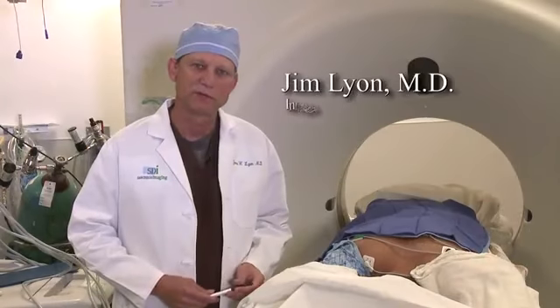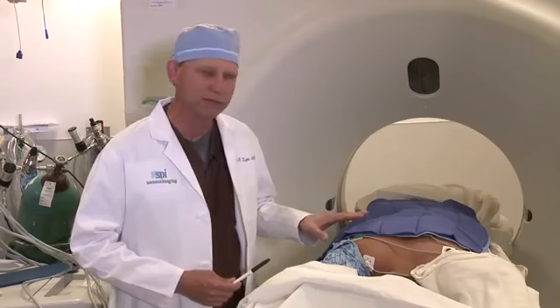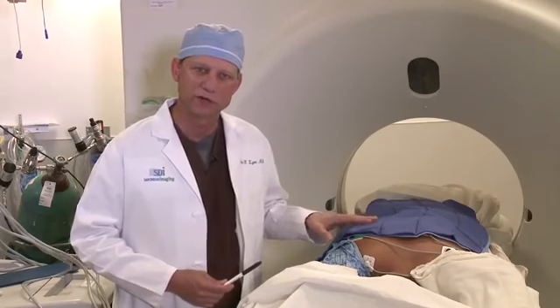I'm Dr. Jim Lyon. I'm an interventional radiologist with San Diego Imaging Medical Group. We're here at Sharp Memorial Hospital in San Diego. I'm going to demonstrate a cryoablation case using the Endocare Cryocare system. I'm very familiar with that unit. I've used it for about 8 years now.